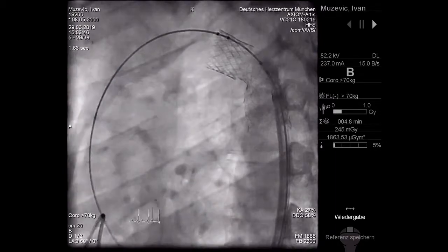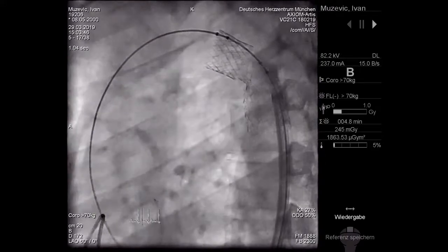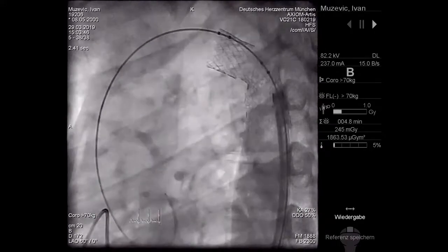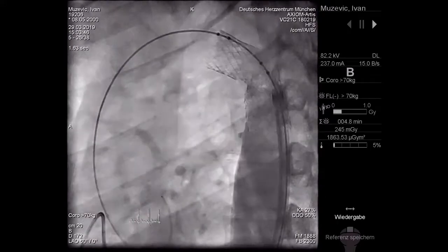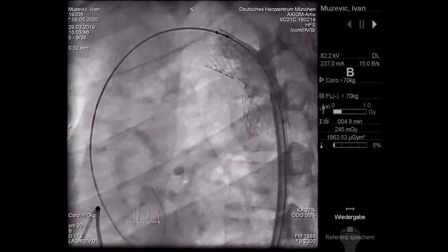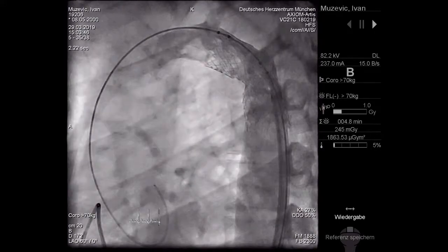Right. And whether it's that point where there is a gradient, because even opposite that, at the posterior wall of the aorta, if you look at the movement, that particular spot is not moving. So I suspect that's where the gradient is likely to be, in which case you might have to stent that part in order to abolish this gradient. And the way the second stent would sit, you still wouldn't have covered the origin of the left subclavian.